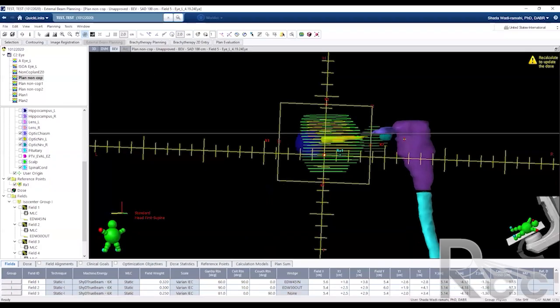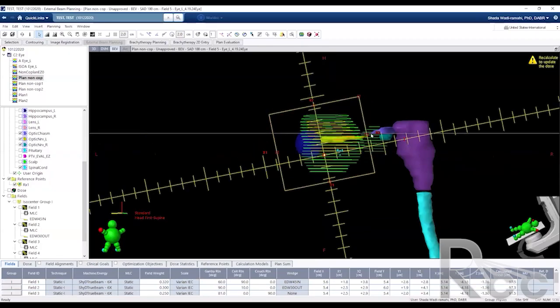Then I could start figuring out the best way to rotate the collimator. So remember we said in 3D planning, rotating the collimator would help. Because if I have the collimator sitting right here, it's abutting the chiasm. And of course I can make it smaller, but then I'll be too close to the PTV. So if I rotate, same collimator size, I did not change the size, but I'm rotating, so I introduce this distance to the chiasm. So that's, for example, one angle.